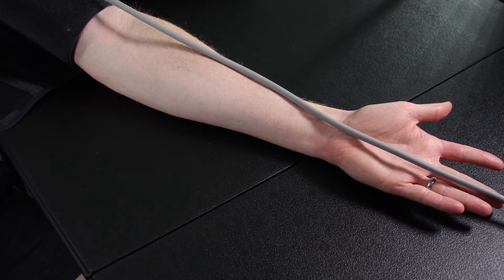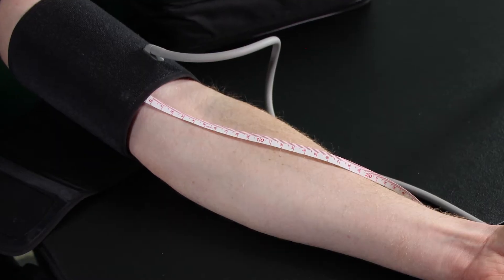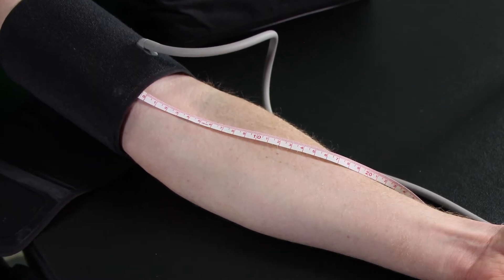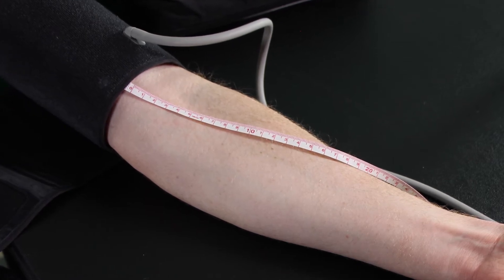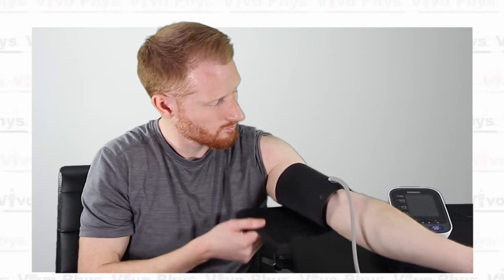This cuff should be placed about one to two centimeters or about half an inch above the elbow or the crease on the elbow and the cuff should be then wrapped with the velcro so that it's firmly attached to the arm.